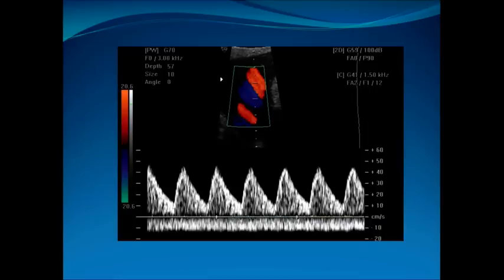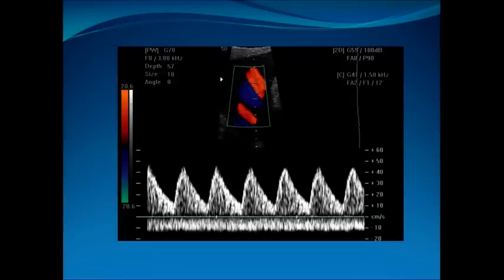Here is another demonstration of sampling over the cord with the characteristic appearance of the umbilical artery signal waveform. Note that there is positive flow above the baseline throughout the cardiac cycle.